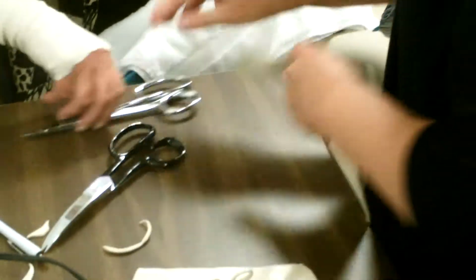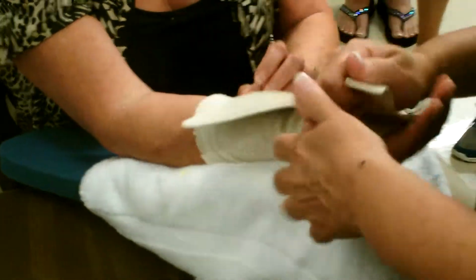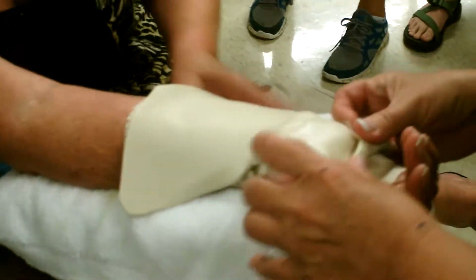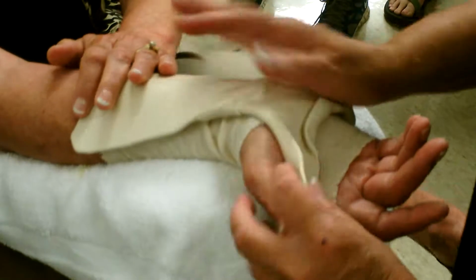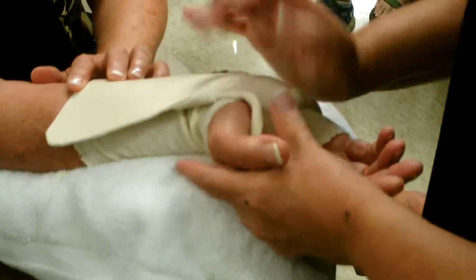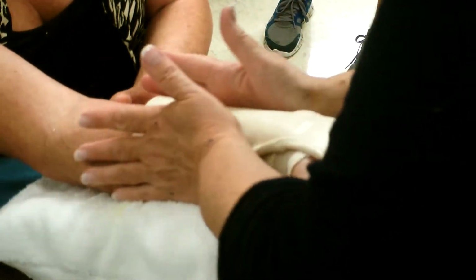Compliance matters. All right, go ahead. Put your arm up here. Okay? Oh, this is crappy. It's okay. So, here's what we do. We roll back like this, like the Walmart roll back. All right, so I'm going to teach you a little phrase: stroke it, don't poke it, baby. I don't want this. If I see fingerprints, I don't like it. Stroke it, don't poke it.